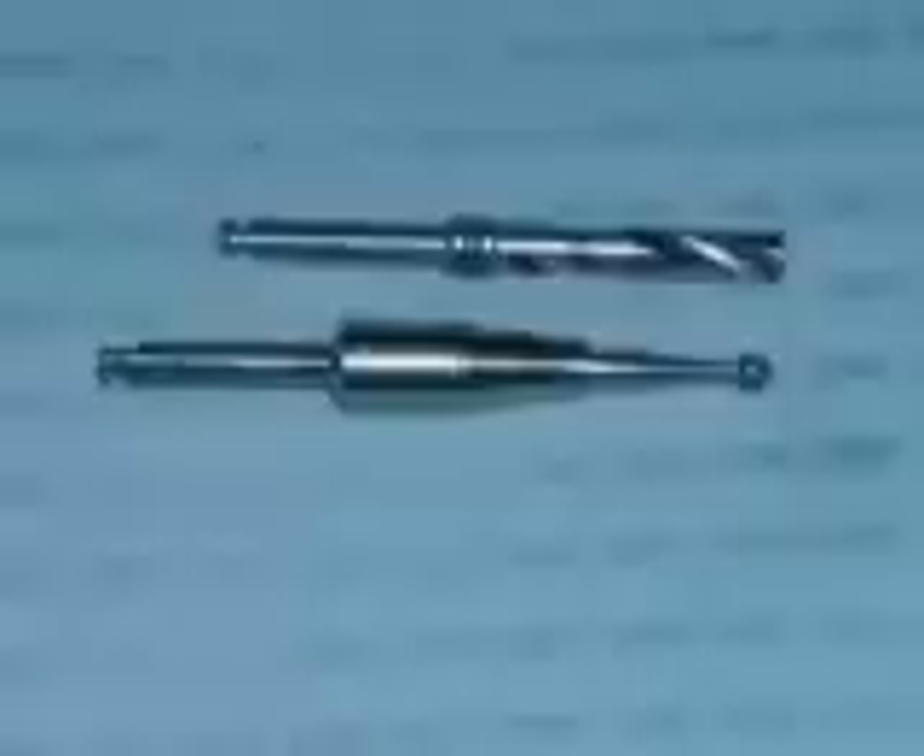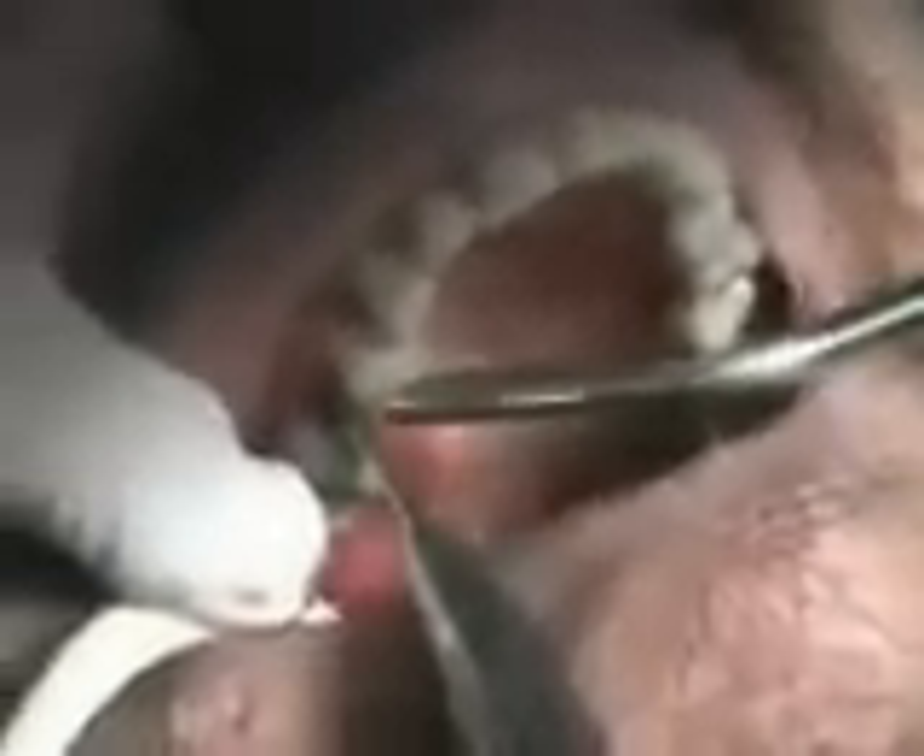This is the drill we're going to be using — a latch-type diamond available from Salvin, connected to a drill extender. We also have the opportunity, if you wish, to use a low-speed long latch bur on a 4-to-1 handpiece, again having less than a 2 to 2.5-millimeter diameter diamond, which will slowly drill and erode away the bone so that we don't have to traumatize the patient by over-compressing with a hammer.